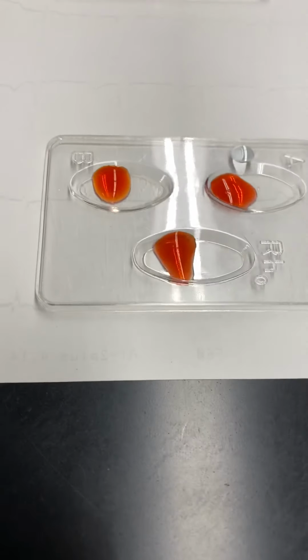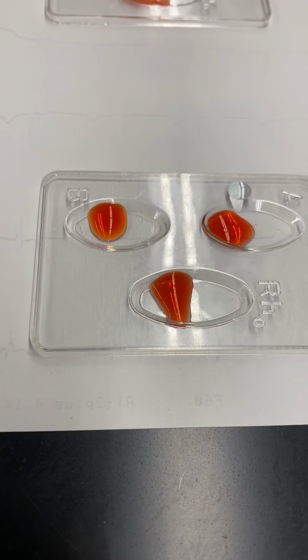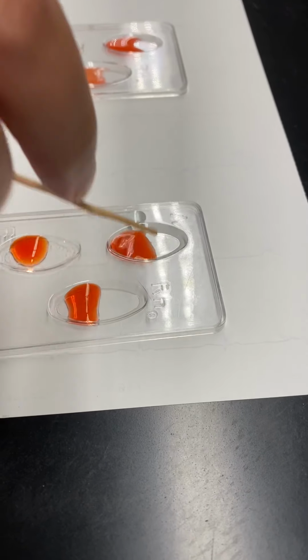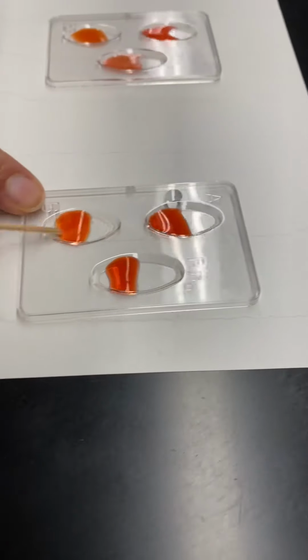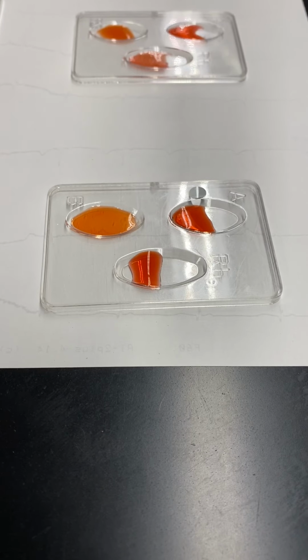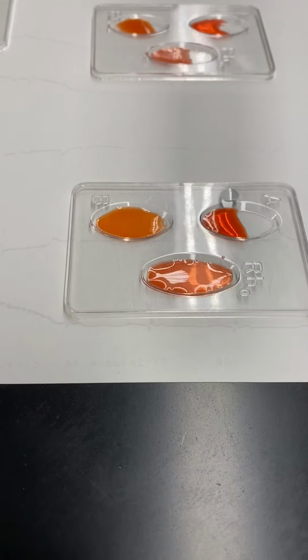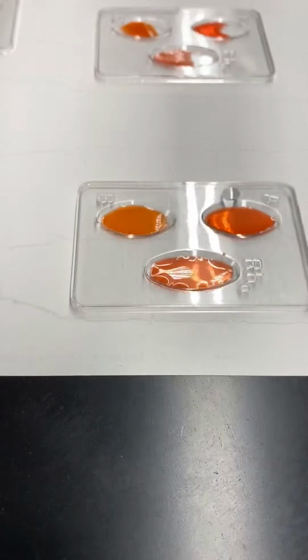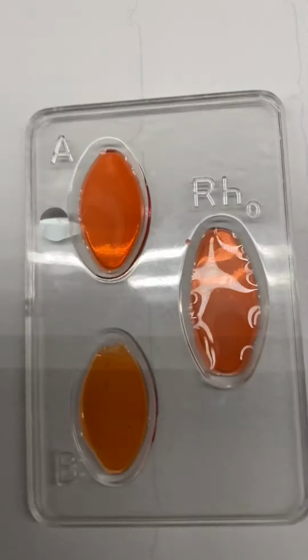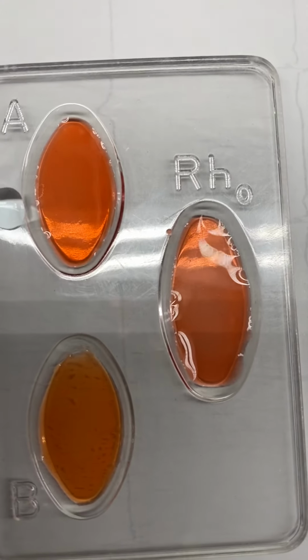And again, what I'm looking for is anything outside what I actually started with, which was a clear blood sample. So I'm going to mix this sample again. So this is one sample. This is another one. I'm going to spread it as much as I can so you guys can see if there is anything. And then this is the third one. So looking at this, take a second to take a look. Based on what you're observing, you should be able to draw your own conclusion.